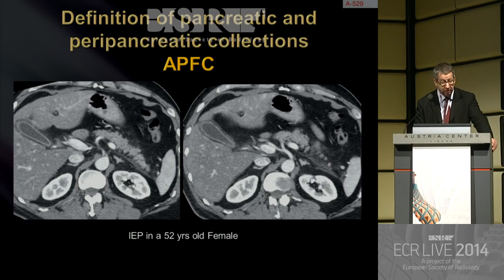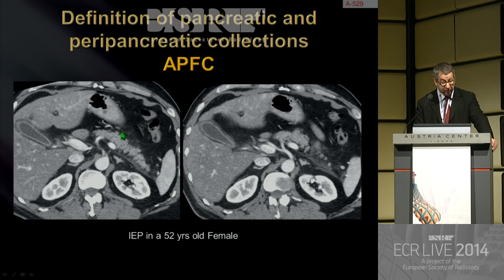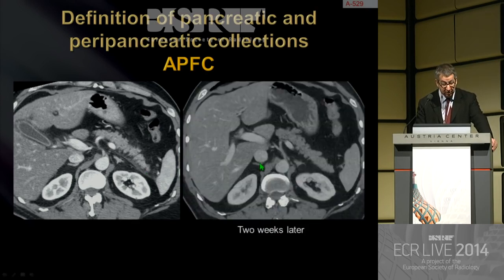Here is an example of interstitial edematous pancreatitis in a 52-year-old female. You have something which clearly looks like APFC: it is strictly around the pancreas, homogeneous, fluid density, and confined to the normal planes. The same patient two weeks later evolves to a normal CT appearance.